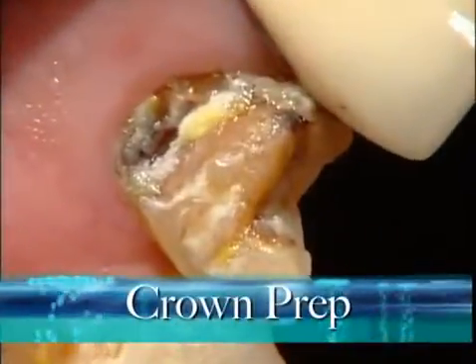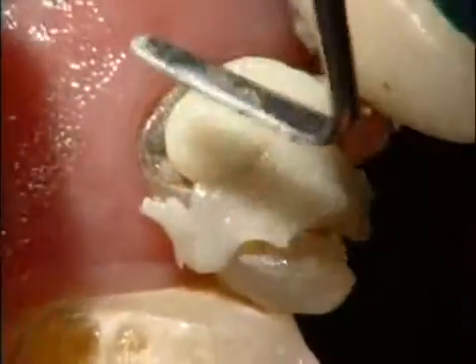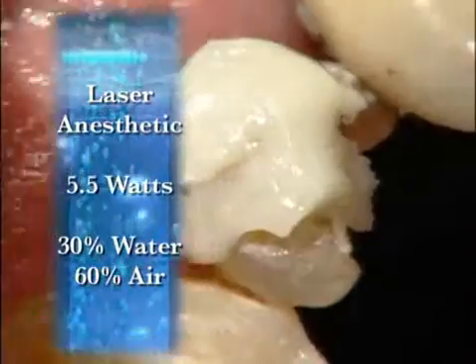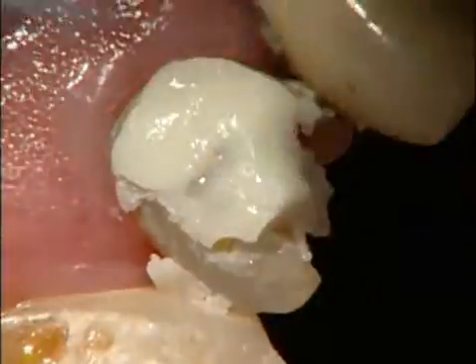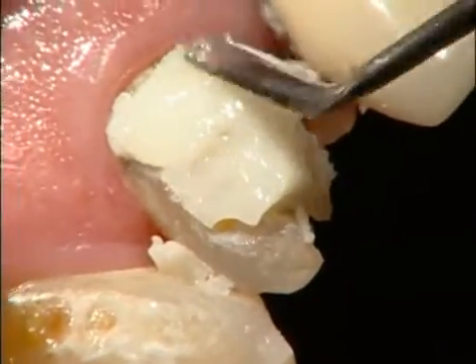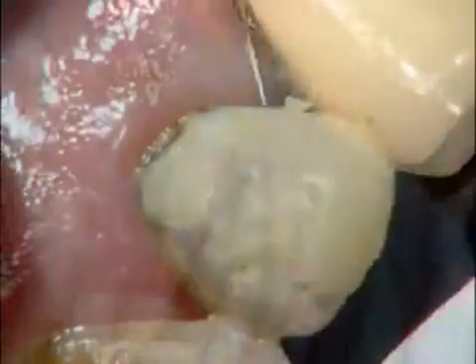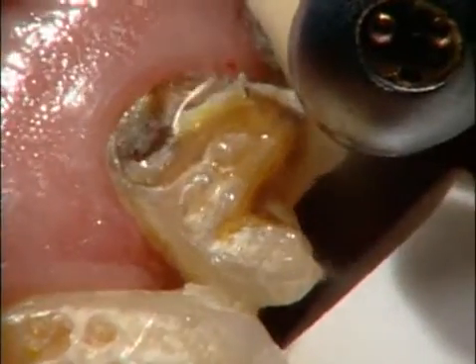So here we have Dennis again. Now I've done the laser anesthetic, 5.5 watts, 30% water, 60% air, 8 to 10 millimeters away from the tooth for 1.5 to 2 minutes. I'm doing just a little composite buildup to allow me to take an impression to make Dennis a little bit nicer temporary. Then I'm going to come at him with the G6 tip.